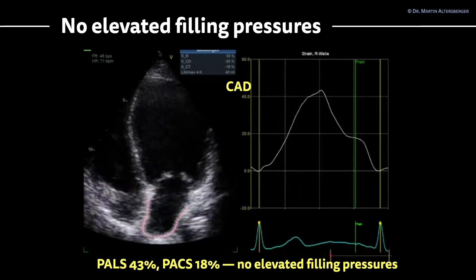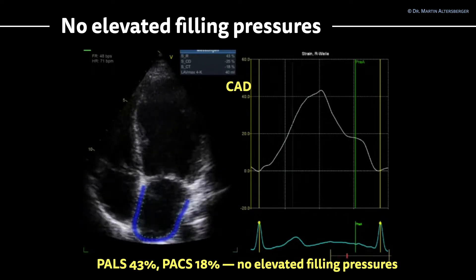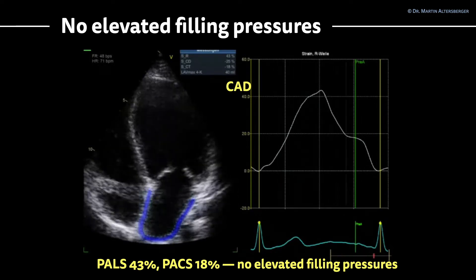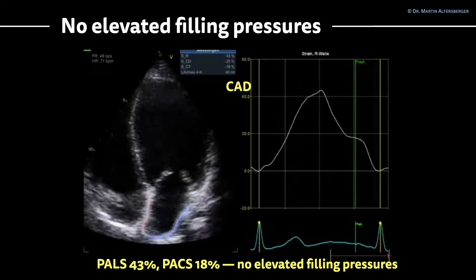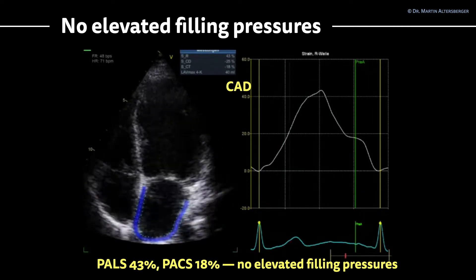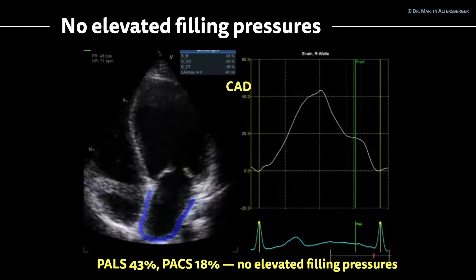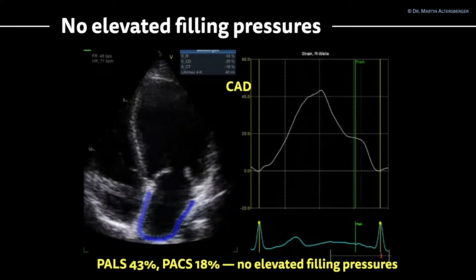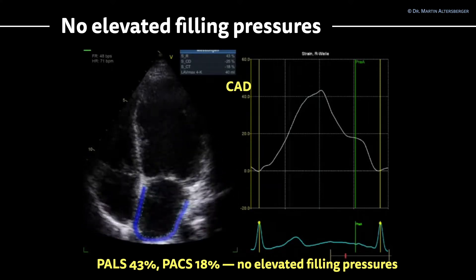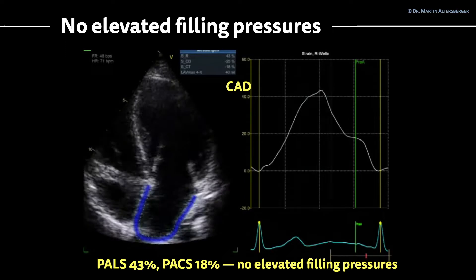In this case, the peak atrial longitudinal strain is entirely normal at 43%. The PaX of 18% is also entirely normal. So in this case, we are practically sure that there are no elevated filling pressures. This was a patient with coronary artery disease and you can see the apical wall motion abnormality, but this patient was not symptomatic. We do know that filling pressures are not elevated.